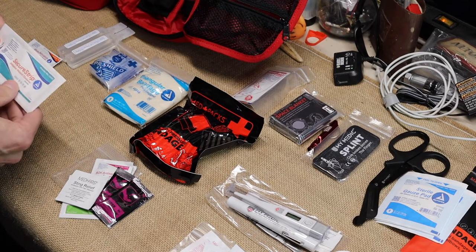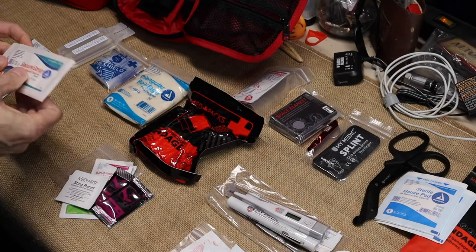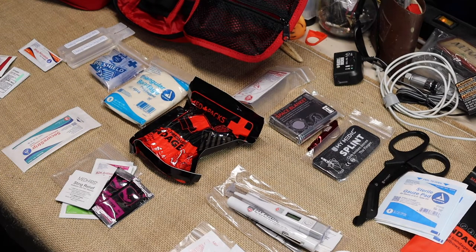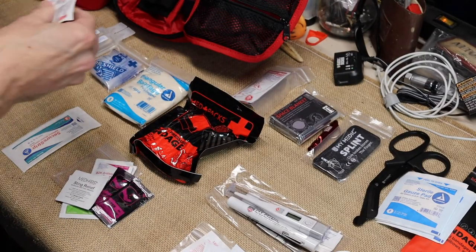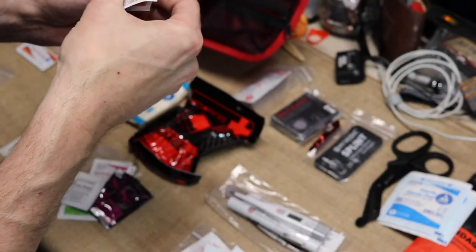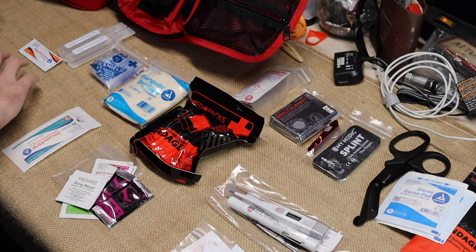The next thing you have is secure strips — adhesive wound closures — used to close up a wound if you need to. Then the next pack is your ointments: triple antibiotic ointment, hydrocortisone, oral pain relief, lip balm, and sunscreen. That's all that's in this first pouch.